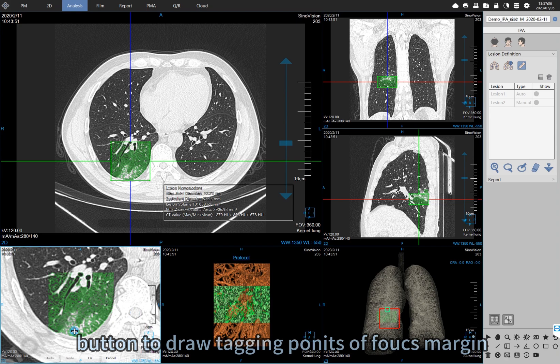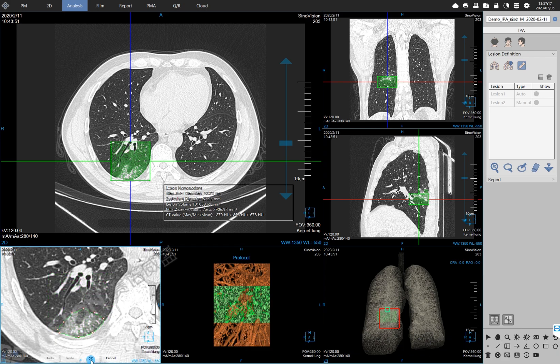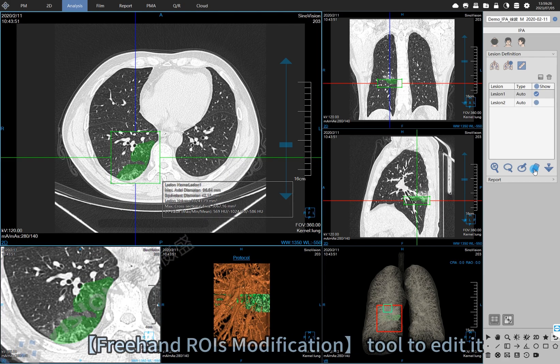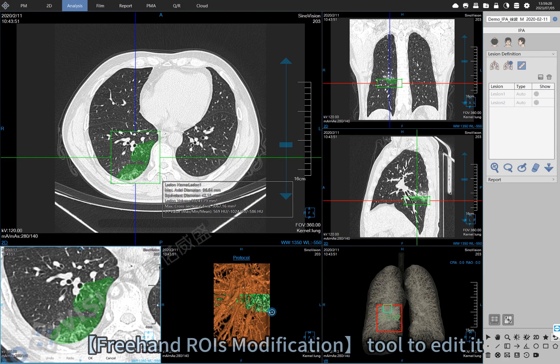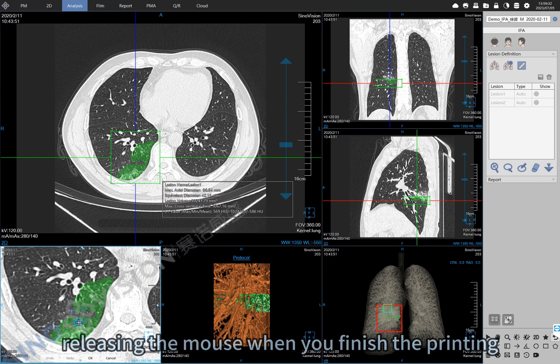Press the left mouse button to draw tagging points of the lesion margin. Press the right mouse button to finish. You can also use the freehand ROI modification tool to edit it — press the left mouse button to draw the margin of the lesion, then release the mouse when you finish.